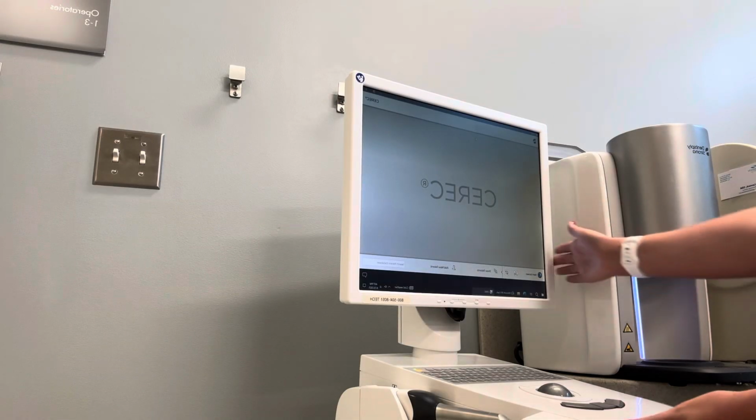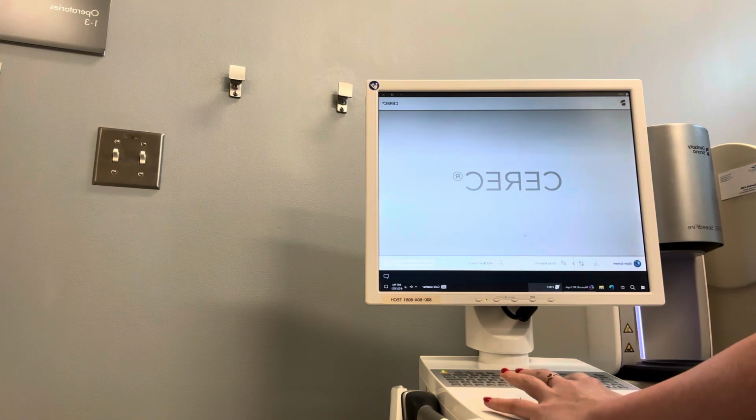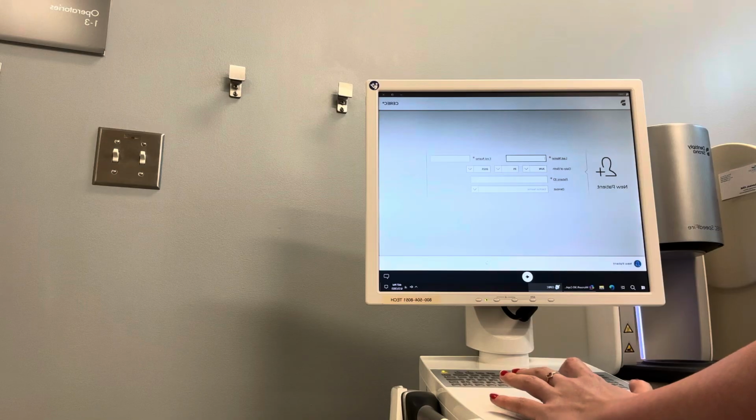Hey guys, this is Lindsay, and I just kind of wanted to show you how to use the CEREC system at Davidson County so that more students are able to utilize this.